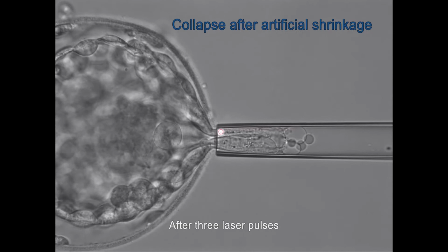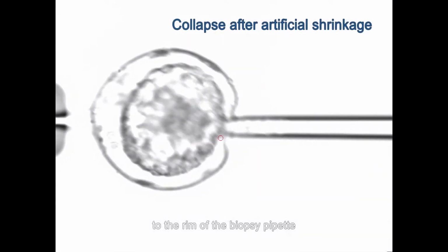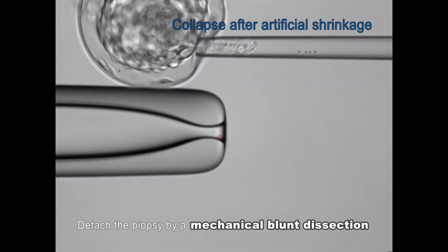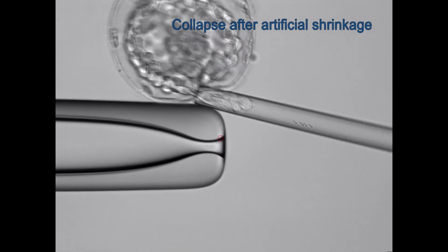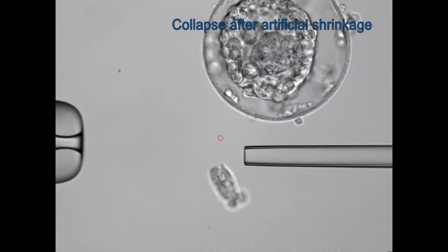After 3 laser pulses, the holding pipette is maneuvered to the rim of the biopsy pipette. Detach the biopsy by a mechanical blunt dissection. Subsequently, the biopsy fragment is released.